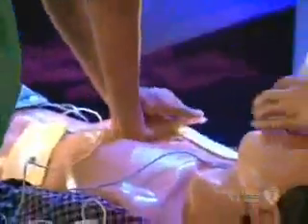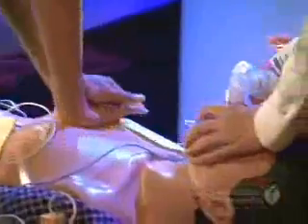Shock advised. Stay clear of patient. Deliver shock now. The AED will then tell you when to push the shock button. I'm clear. You're clear. Clear. We're all clear. When the shock is delivered, the victim's muscles will jerk. The AED will then tell you to start CPR, beginning with chest compressions.